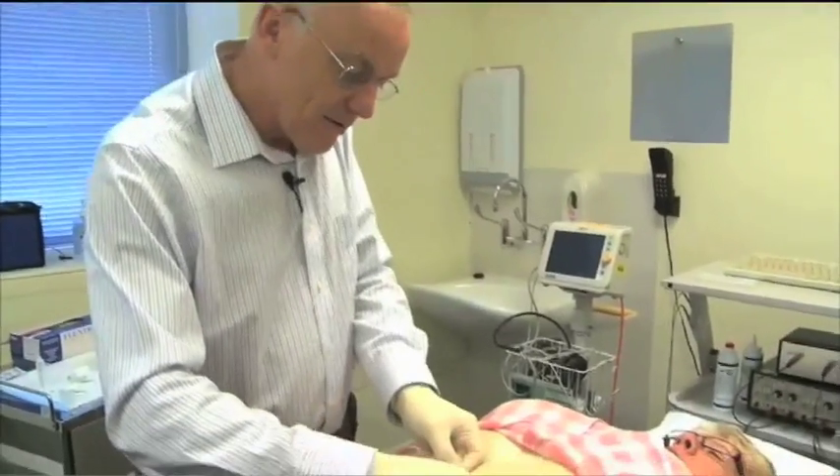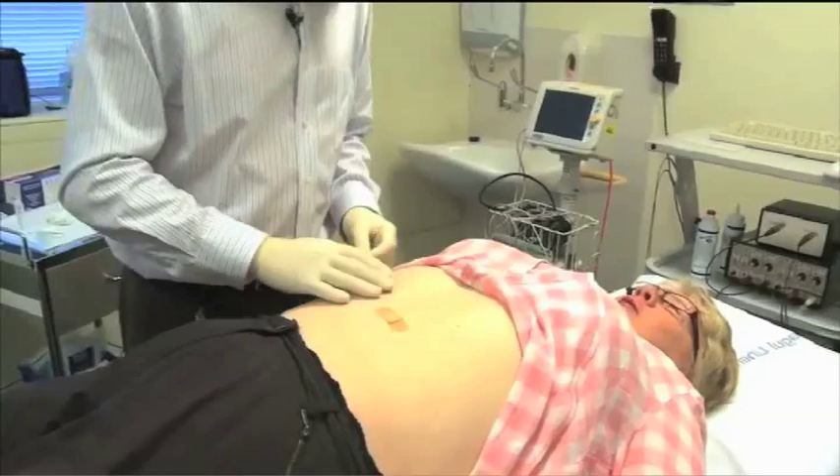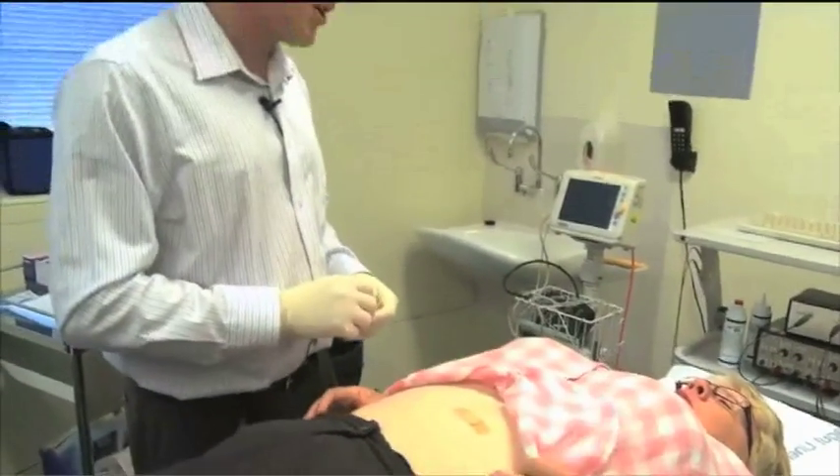As simple as that. The adjustment should be a very simple, a very painless procedure. Okay, Lynn — not too traumatic? No, that was fine. Thank you. Okay, now I'm going to get you to sit up and we'll give you a drink just to see that everything's going down okay. Great, thank you.